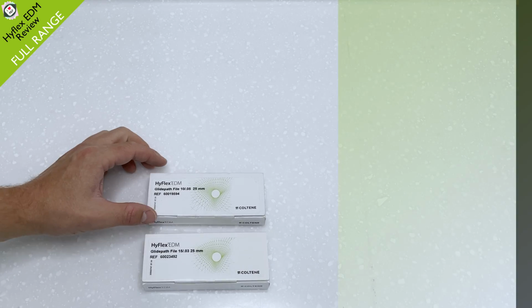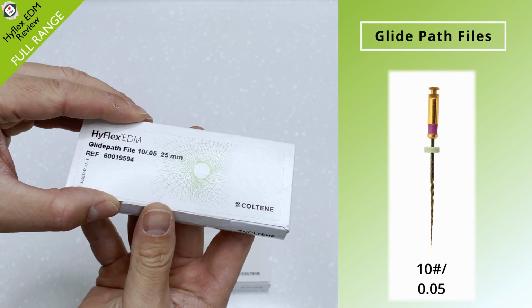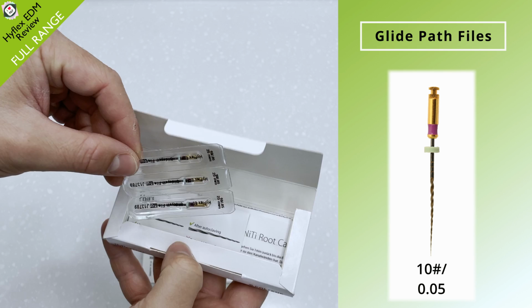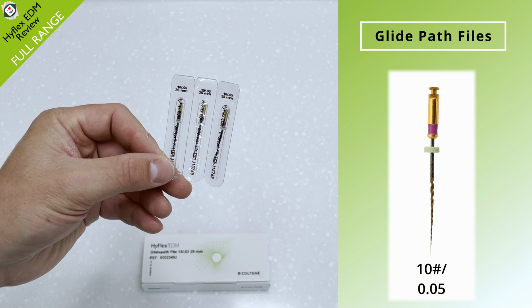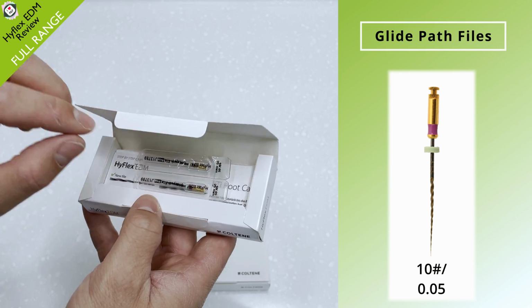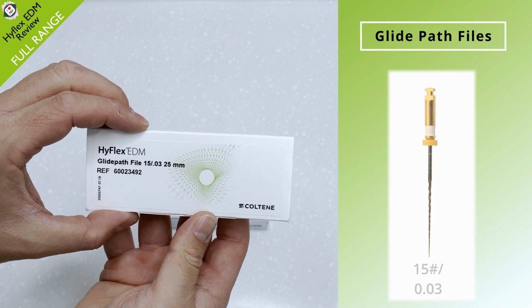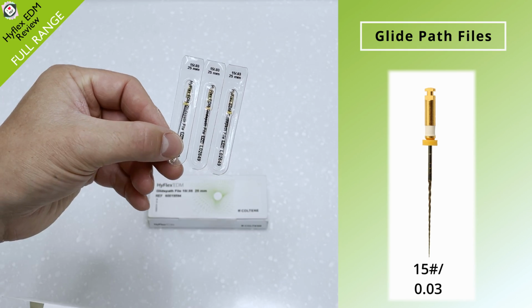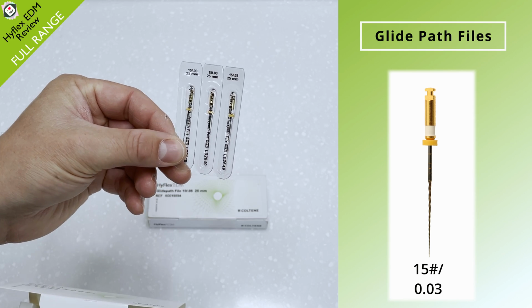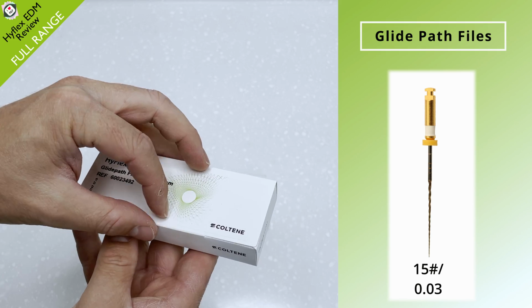So the first group of files are the Glidepath files, and they include a size 10 with a 0.05 taper and a size 15 with a 0.03 tapered file. What's really interesting about this file protocol is the size 15 is actually used before the size 10, and at first this was something that I couldn't get my head around, and it will be explained in a live demonstration further on in this video.